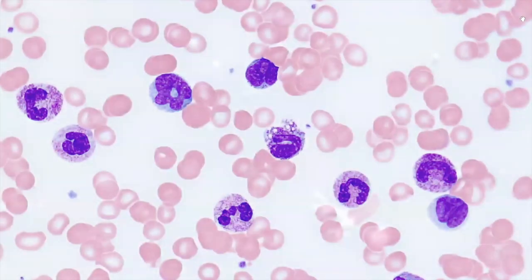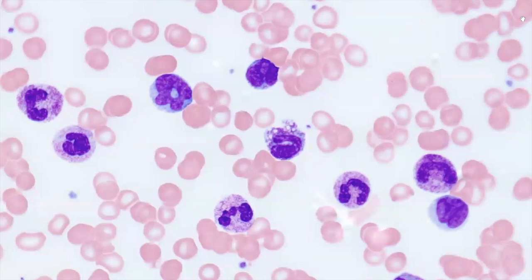Toxic vacuoles are round, clear spaces in the cytoplasm and represent sites of digestion of phagocytized material. Toxic vacuolation refers to the presence of a variable number of vacuoles in neutrophils and bands. They may be seen in some or all of the neutrophils, and occasionally are seen in eosinophils. These changes also accompany other toxic changes and are associated with essentially the same clinical conditions, such as severe infections, burns, trauma, and G-CSF. Marked vacuolation is considered a characteristic finding of septicemia.